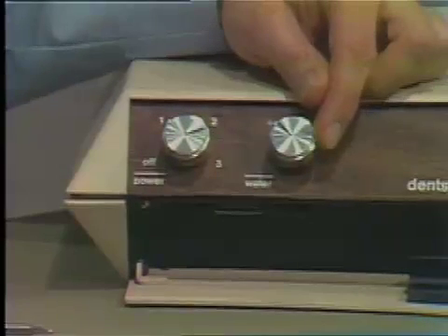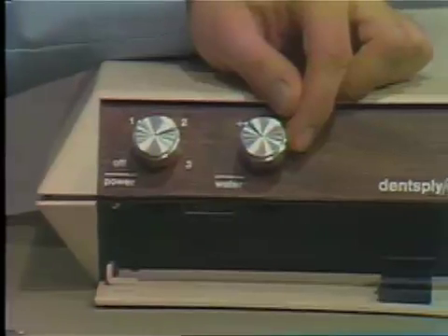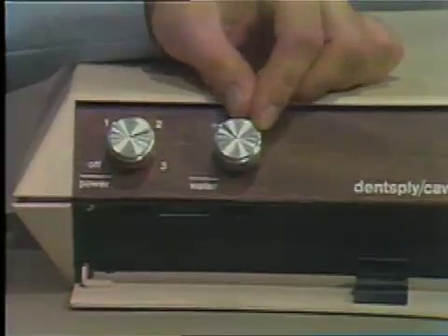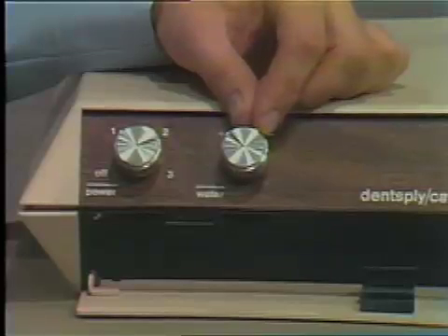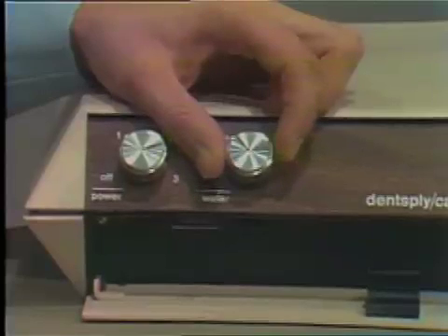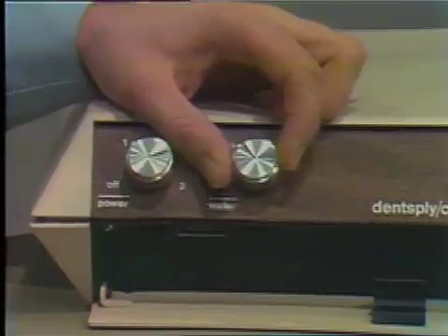The water adjustment is used to cool the tip of the instrument, as heat is produced when the ultrasonic scaler is being used. You should use enough water to get a fine slurry hitting the exact tip of the instrument, which should keep the instrument cool enough to work with. It's important to use a very light touch when using the scaler to eliminate heat buildup.